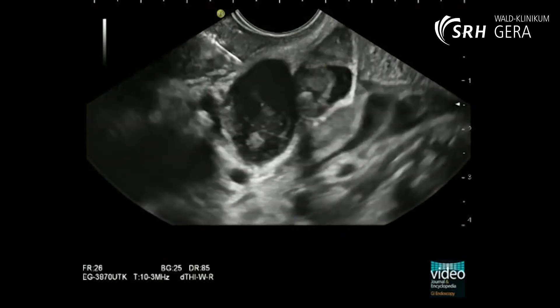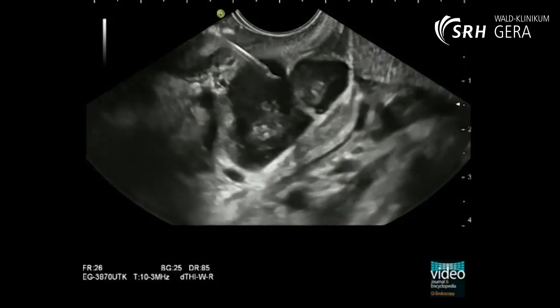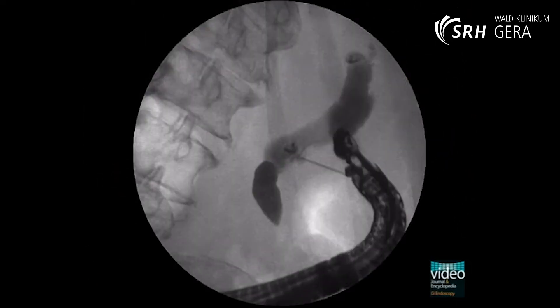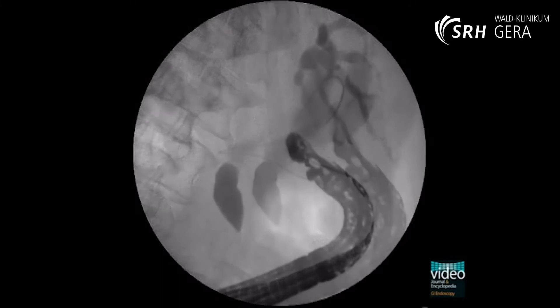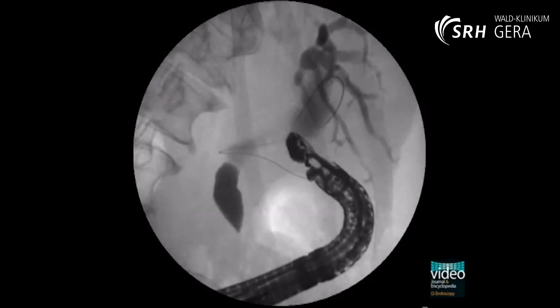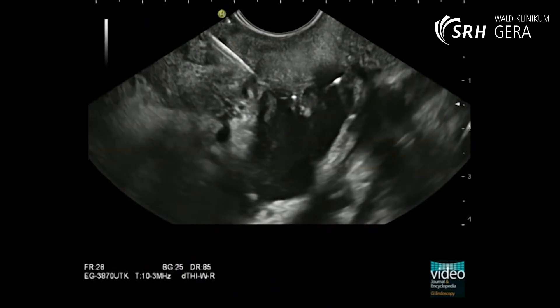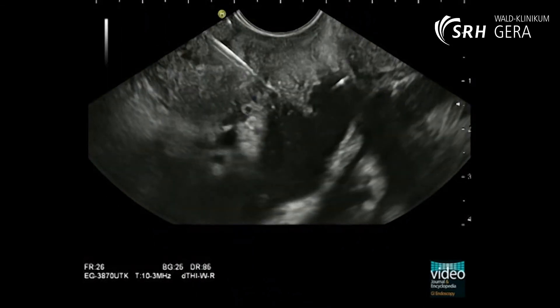The transduodenal puncture of the common bile duct through the peritoneal cavity is performed with a 19-gauge needle. Using contrast media, control fluoroscopy confirms the dilated bile ducts and absent bile drainage through the papilla into the duodenum. Under EUS and fluoroscopy guidance, a 0.035-inch guide wire is inserted through the needle into the bile duct and should be introduced as far as possible into the intrahepatic branches of the biliary system.